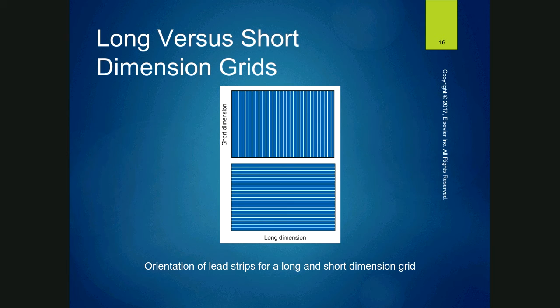Well, the opposite is true for X-rays and the use of grids. For grids, we want all of the useful X-rays to get through. We're not really trying to block much out. We're just trying to block the stuff that's gone awry and is coming from the wrong way. So you want to make sure that you have everything lined up as much as possible so that you don't get grid cut off. I'm sure there will be questions about that, but we'll see.